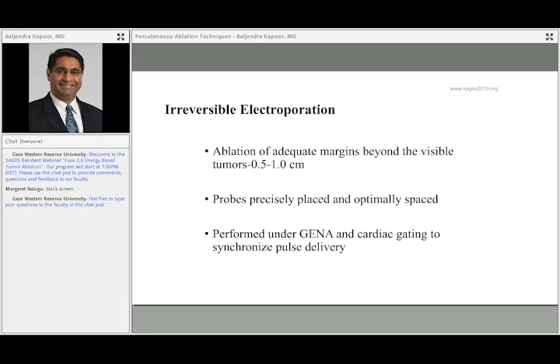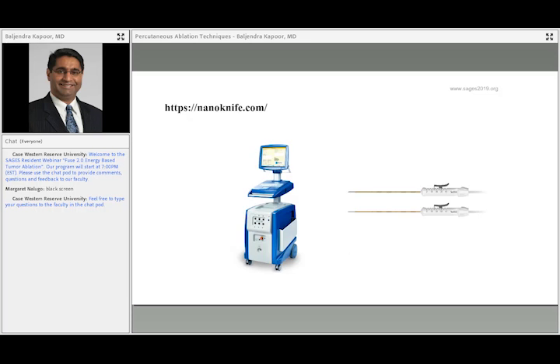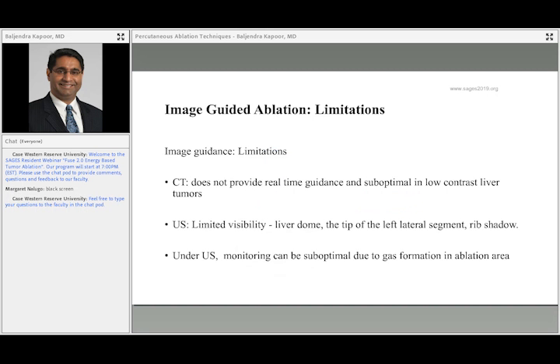And you need adequate margin, as the previous speakers have said, up to 1 centimeter, and ablation probes are precisely placed and optimally spaced. This is performed under general anesthesia and cardiac gating to synchronize the pulse delivery, although the other ones can be used with moderate sedation. And this is the equipment.